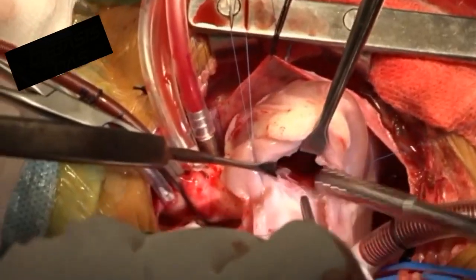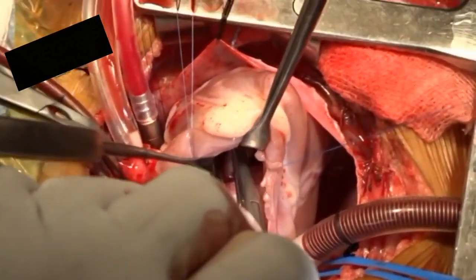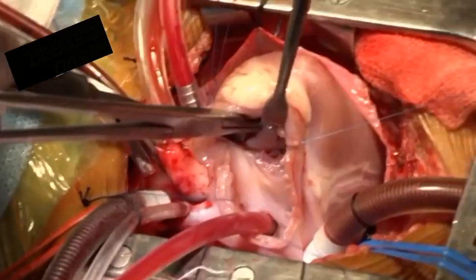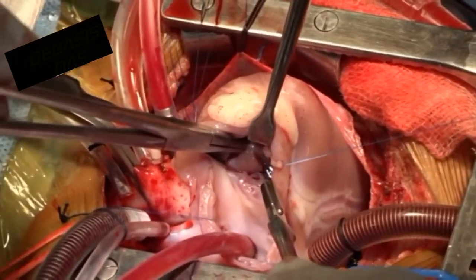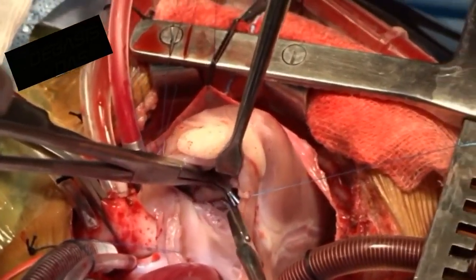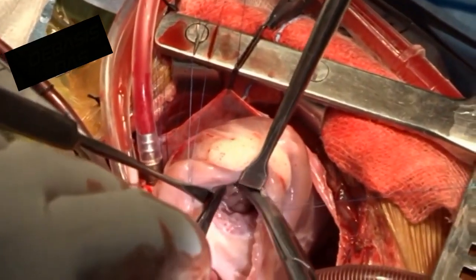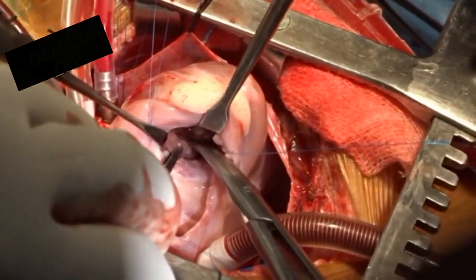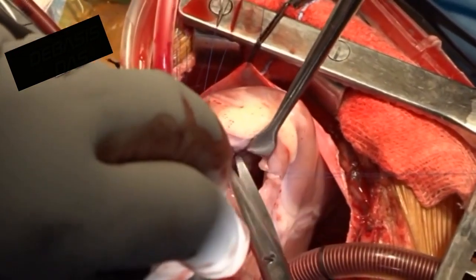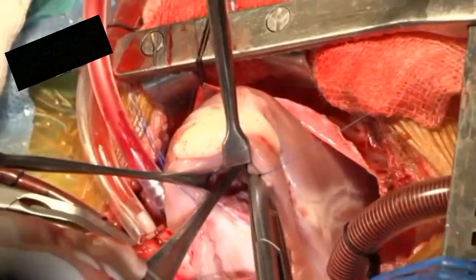The next step is resection of RVOT muscle bundles. The hypertrophied parietal band is hooked with a right angle forceps and then, as we can see, is being divided. It is also important to take a chunk of the muscle away after division to open the RVOT completely. All the parietal wall muscle bundles are then resected.